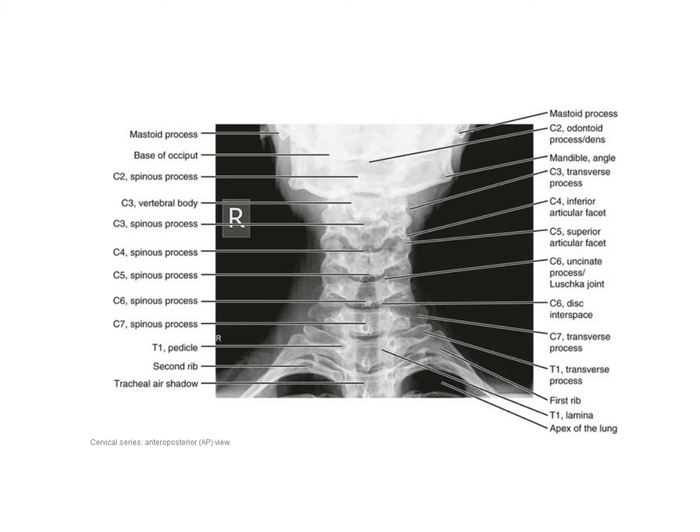The cervical spine anteroposterior view shows the mastoid process, the C2 spinous process, the odontoid process or dens, the atlanto-axial joint and atlanto-occipital joint, then C3 through C7 and T1. Here you can see the tracheal air shadow and the apex of the lung. Also the intervertebral joints can be seen.